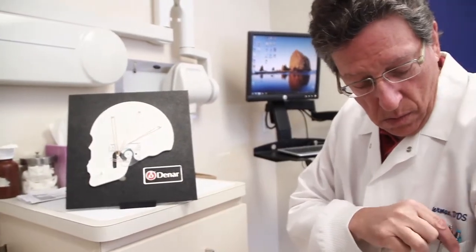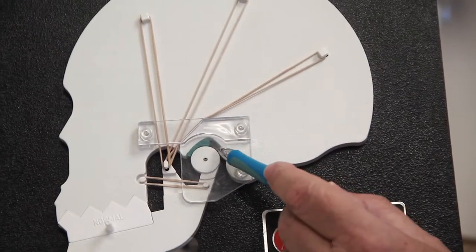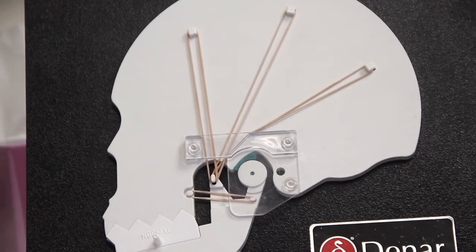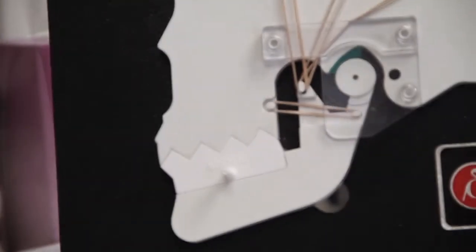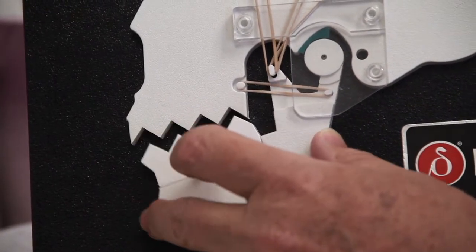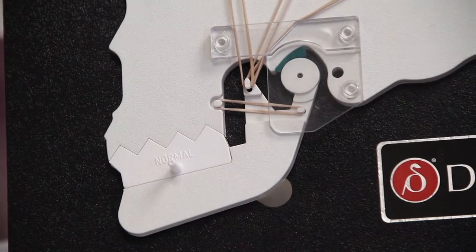We all know that this is the TMJ — the condyle here, the black dots at the center, the green is the cartilage. This is the retrodiscal area, this is the ear hole, and these are the muscles. What we have in here now is the jig that says normal. When you have the normal jig in and you open and close, the lower teeth fit beautifully into the upper teeth, and all the TMJ apparatus and muscles move very smoothly with nothing degenerative happening.